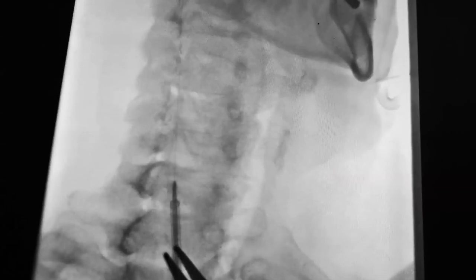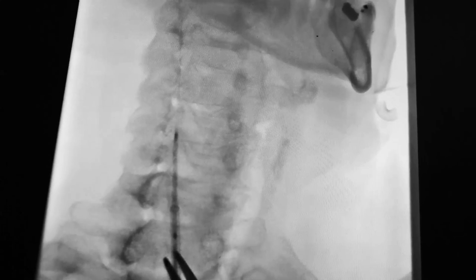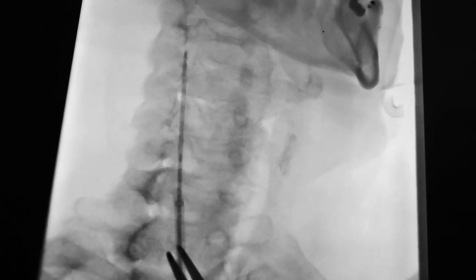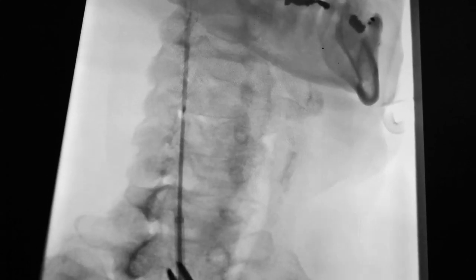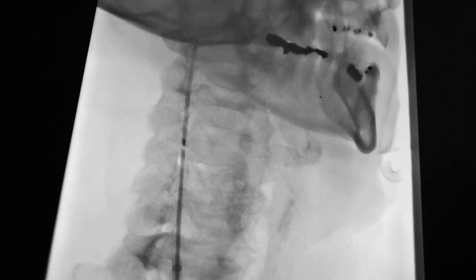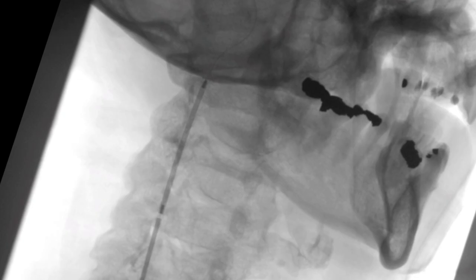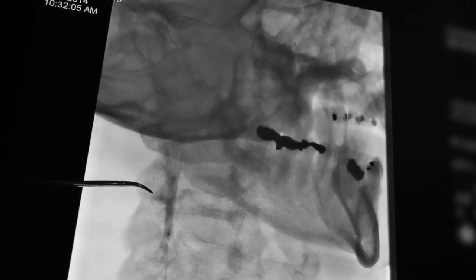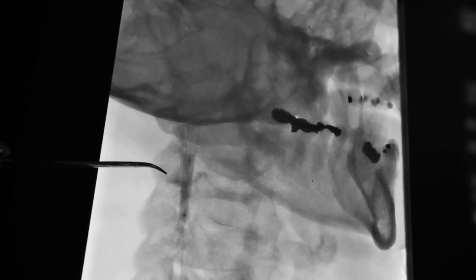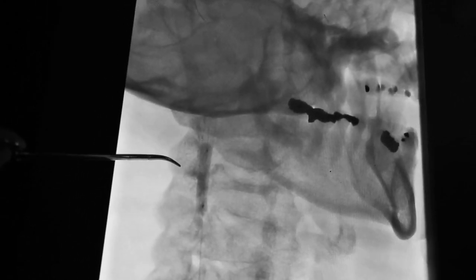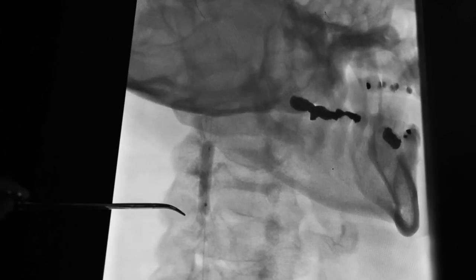The lesion was crossed with the 0.014-inch Asahi ProWater wire and subsequently the carotid stent was advanced across the critical stenosis. After deployment of the stent under direct visualization, post-deployment balloon angioplasty was performed with a 4 mm by 20 mm balloon.